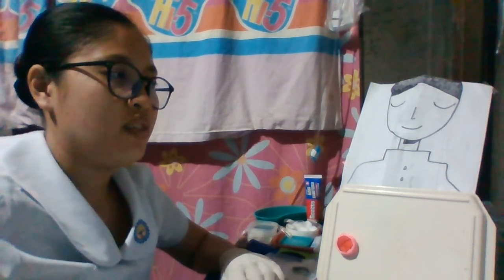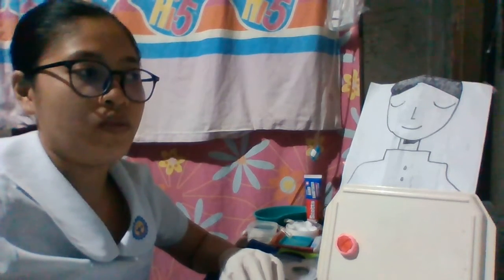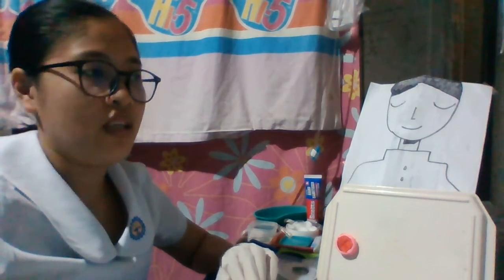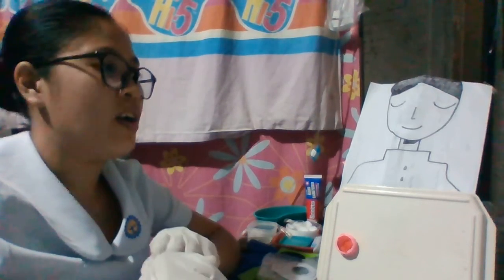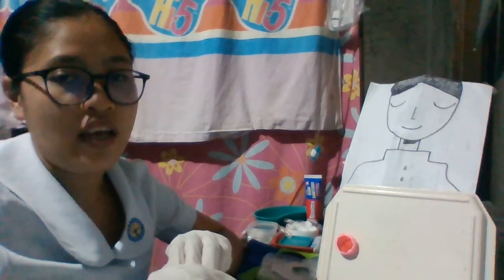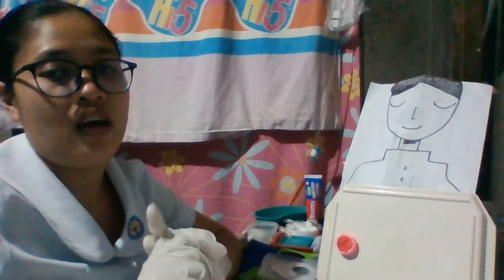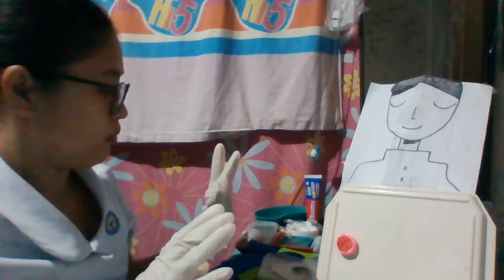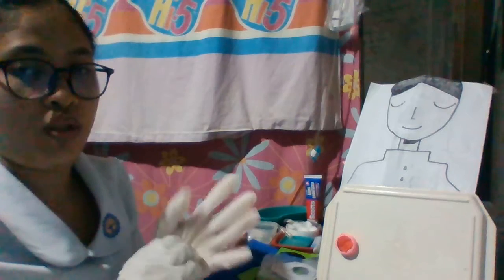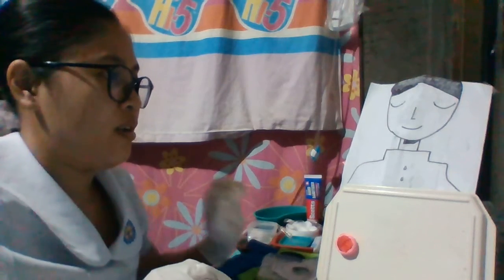The skin must be absolutely dry; make use of paper on part of the skin or a hair dryer set on cold to assist in drying, to make sure that the skin is dry before applying the pouch. Then have the colostomy pouch ready by removing the backing from the barrier.